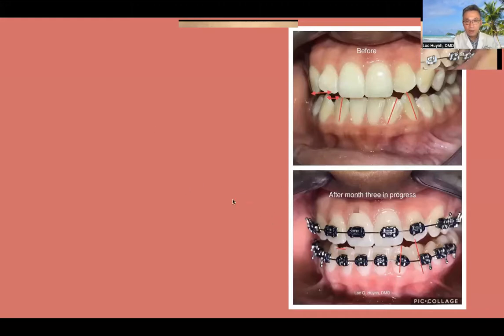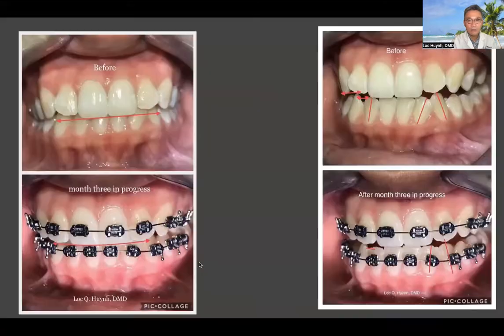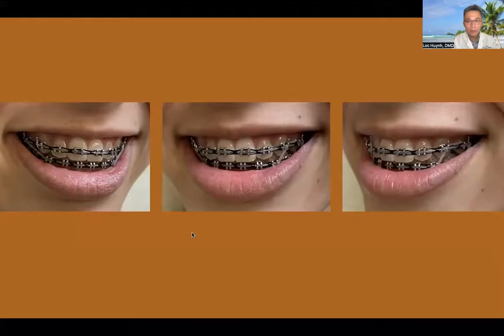With continued treatment, you can see that the bottom tooth is now aligned really nicely, and it's also upright too. The roots of the incisors are upright. It's the same thing on the central and lateral incisors. There's a slow improvement there. So again, the teeth were off, but look at it now, all those incisor edges are in one line. Before that, they're not. They are up in the air right there. Number 7 and number 10 were way up there. Look at that rotation. The more we put braces on, the more you see.